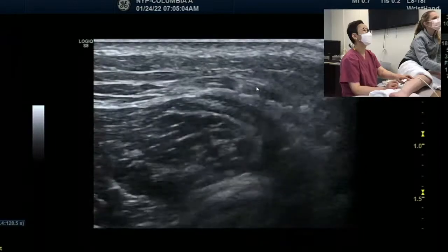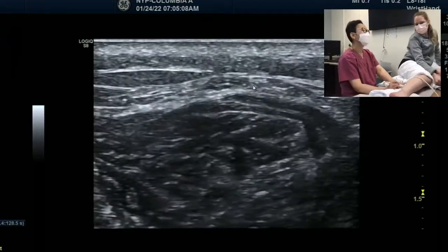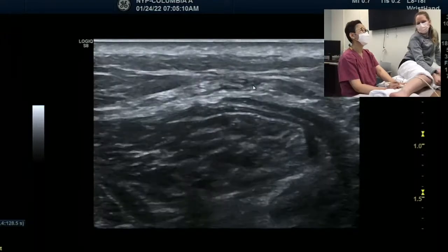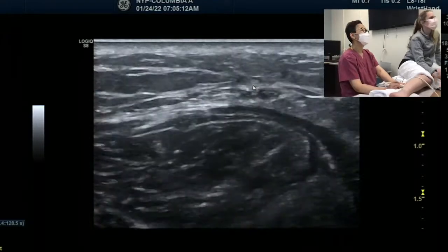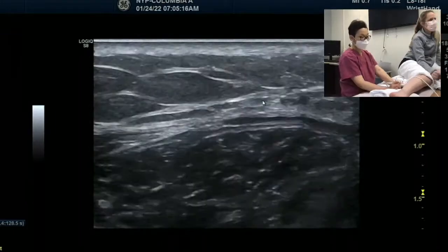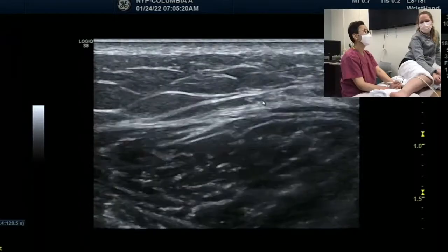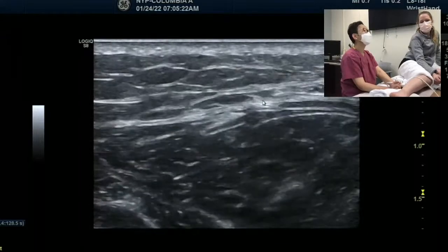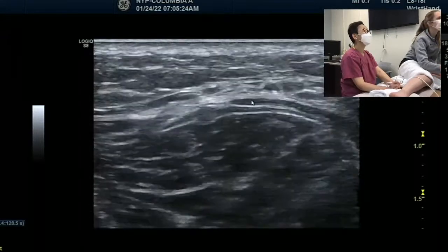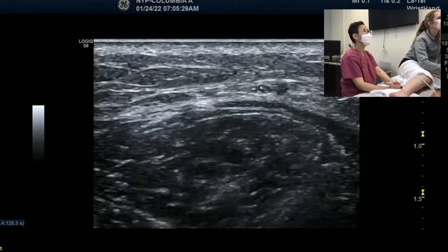It's moving. So look at this. I'm going almost a little more medially, right? Yeah. That one. So look at this. This is about 14 centimeters. So you guys pick up the sural very superficially, it's placed over there. Look, I'm gonna put it underneath that one. You can see it?